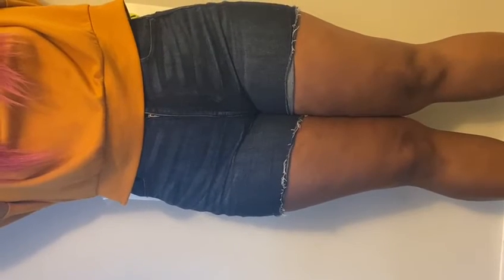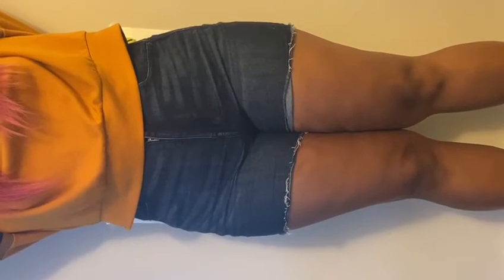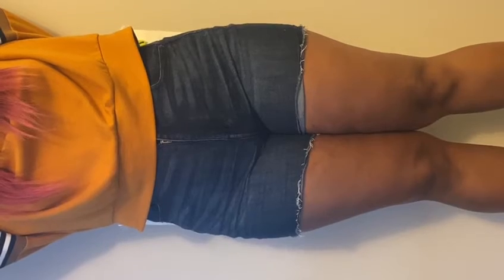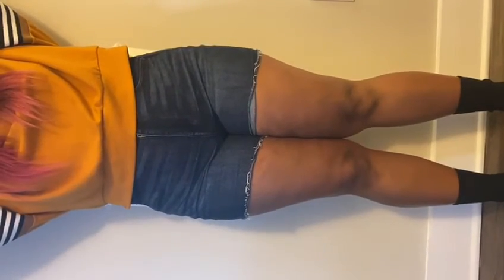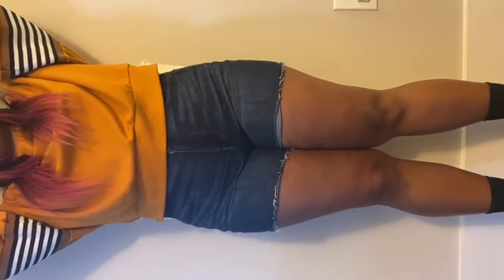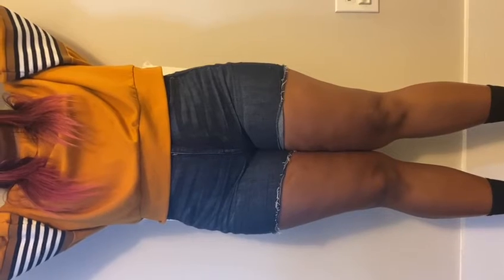For pelvic outlet view and pelvic inlet view, we're gonna use a SID of 40 inches and a cassette of 14 by 17. Before we leave the room, we wanna say to the patient, do not move and do not breathe. For pelvic outlet view, we're gonna have the patient straight up, AP position, and medially rotate the legs 15 to 20 degrees.